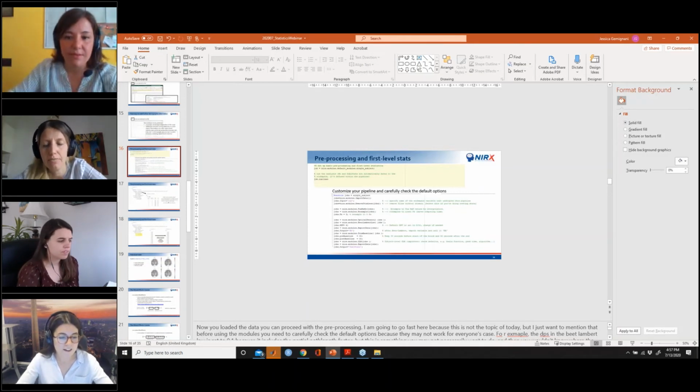We are receiving many. Thank you so much, everyone. Blanca, here comes another question. Is the Benjamini-Hochberg correction for the number of channels only, or also for the number of conditions and oxy and deoxy hemoglobin?